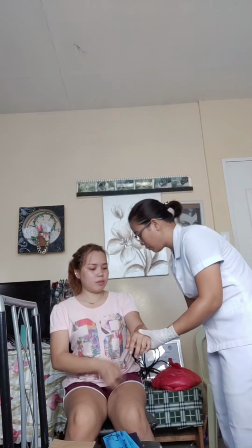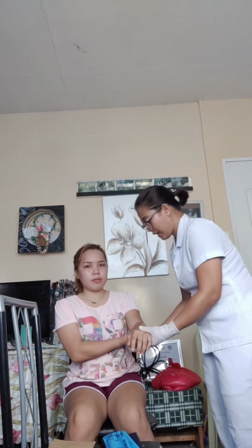So support both below and above the site of the injury. If you are alone, you can ask the patient to support her arm so that we could proceed to the next procedure. Ma'am, pwede niyo magunitan imuhang under sa elbow, ma'am, sa imong fractured area. This is to prevent further injury and minimize the pain during the splint application.